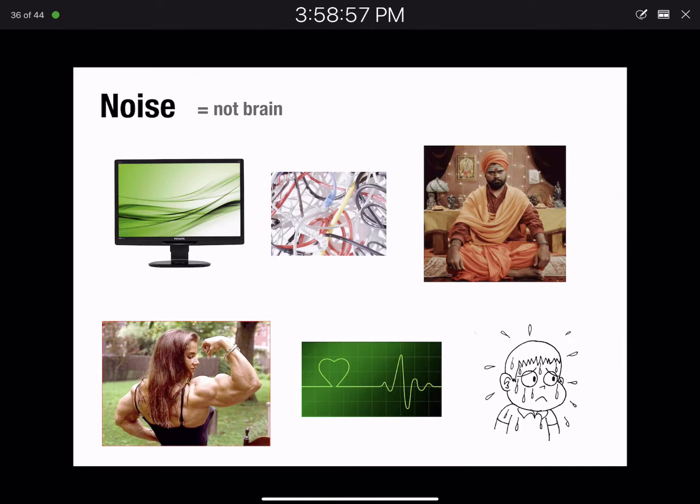So you don't have to worry about trying to isolate your subject from everything within the room. You just need to make sure everything's reasonably far from people and that they're not sticking their feet out or reaching out and touching stuff. You also want them to be as relaxed as possible to minimize muscle tension, but not so relaxed that they fall asleep. So there's a fine line there. In my lab, we try to seat them in a chair that's not super uncomfortable, but not super comfortable, and also give people frequent breaks where we offer them chocolate and caffeine to help keep them awake and alert.